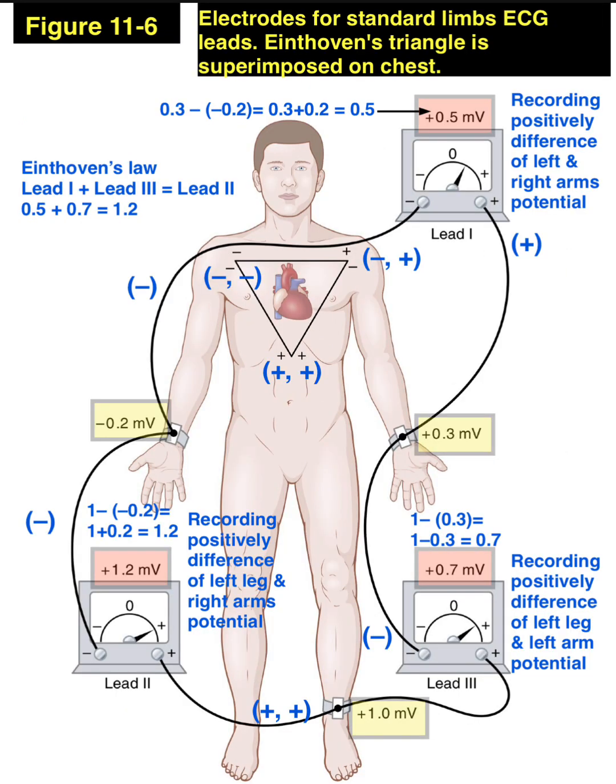This figure is about electrodes for standard limb ECG leads, Einthoven triangle, and Einthoven law.